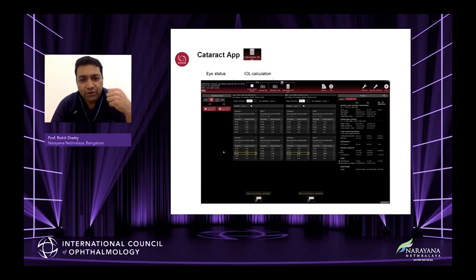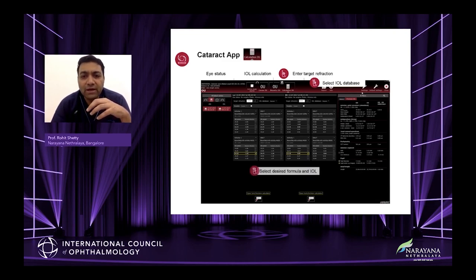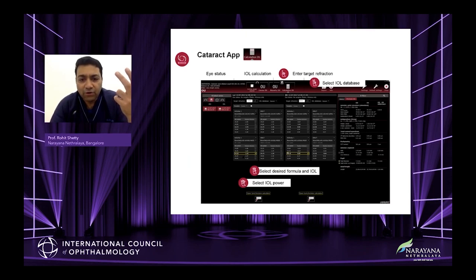And of course, there is a huge bunch of IOLs out there. Once you have a formula, which we'll discuss now, you can just log on to any of those formulas, choose the IOLs, and even change your eye constant. These things are all quite common, like entering the target refraction and how it gets selected from your IOL database. So basically, it can penetrate a dense cataract. You can choose the state of the eye. You can have a big IOL database from which you get your IOL power and IOL formula, and basically it's all in one program built in.